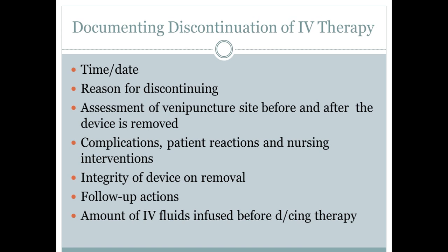When you take the IV catheter out, it's very important that you have some gauze, or a cotton ball, or something that you can use to apply pressure to the IV site. It's not always going to bleed, but at times it will bleed, and it's important that you are applying pressure. And you might even educate the patient on why you're applying pressure, and have them apply pressure.